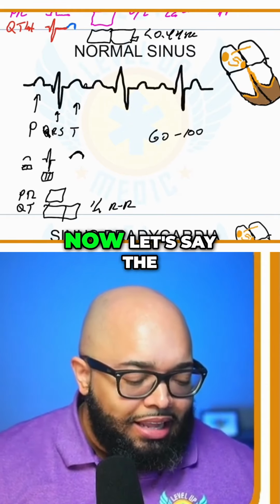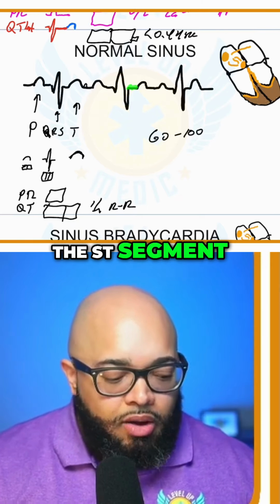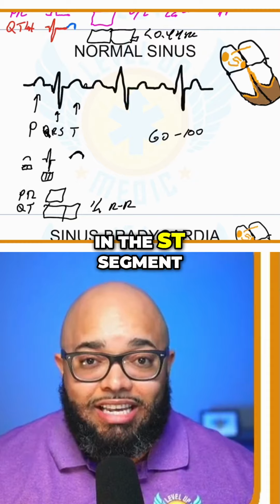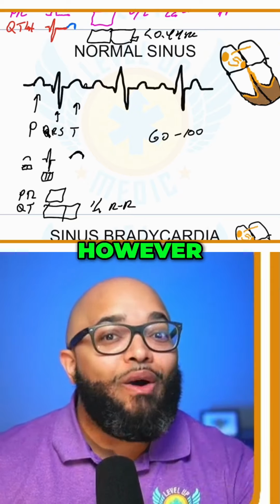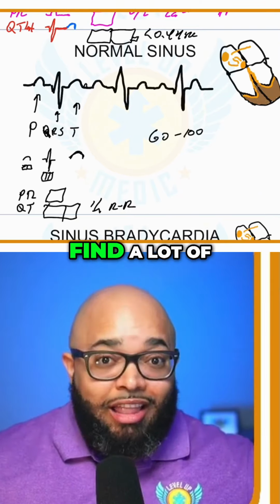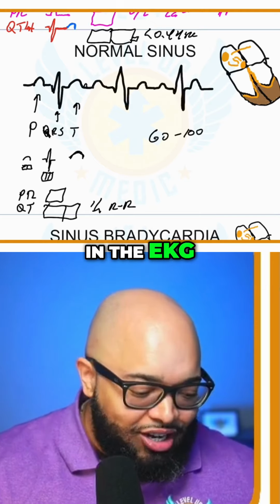Okay. Now, obviously, if we're talking about the ST segment, we're going to look for elevation versus depression in the ST segment. So just by knowing normal, we can quickly figure out abnormal. However, if you don't really understand normal well, you're not going to find a lot of these things. Remember, you don't find what you're not looking for in the EKG.